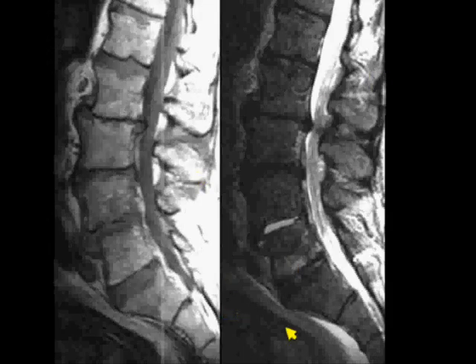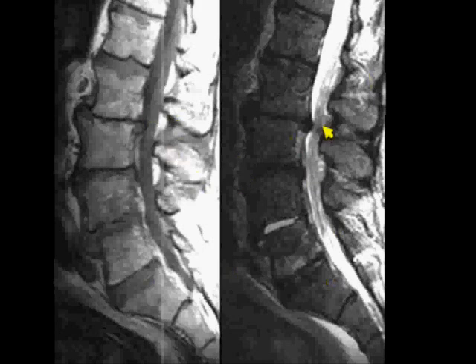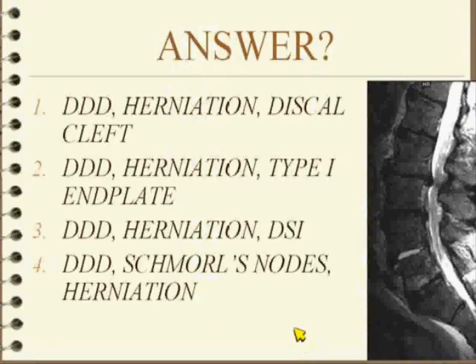Here's another example. What are you going to do with this? T1, T2. A lot of stuff going on — degeneration here, some other findings. Is this degenerative disc disease, herniation, and discal cleft? Is it DDD, herniation, and type 1 end plates? Is it degenerative change, herniation, and a disc space infection? Or is it degeneration, Schmorl's nodes, and a herniation?